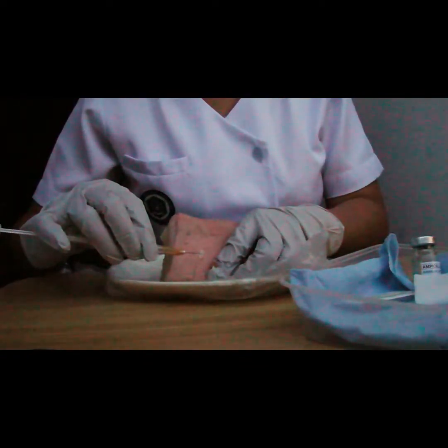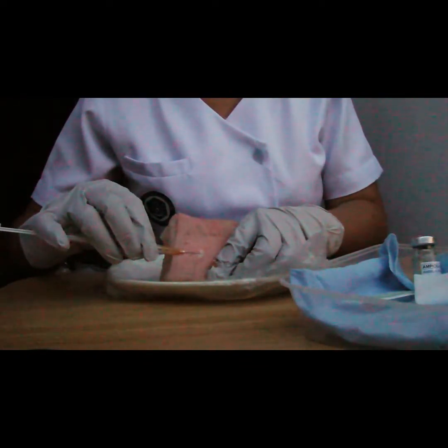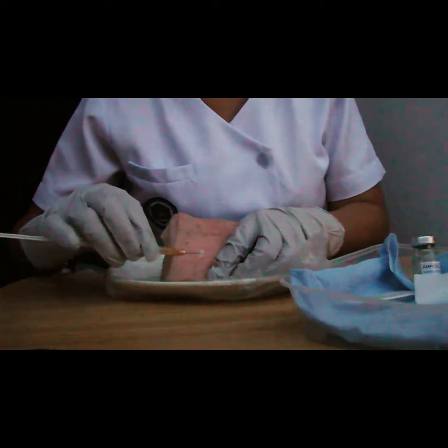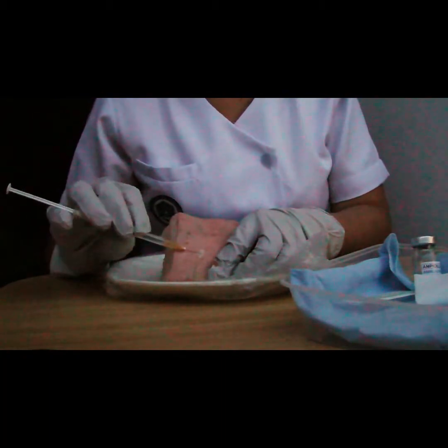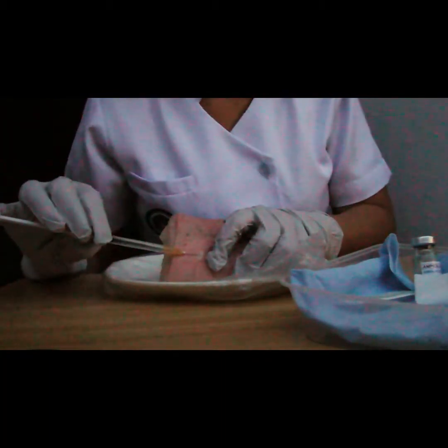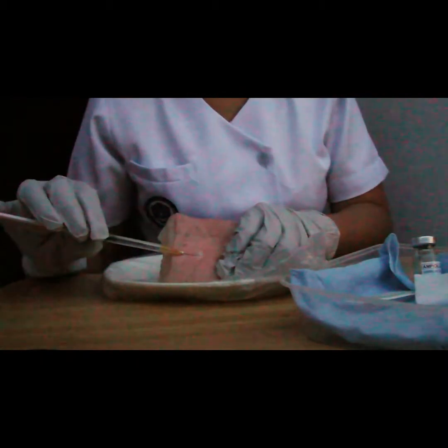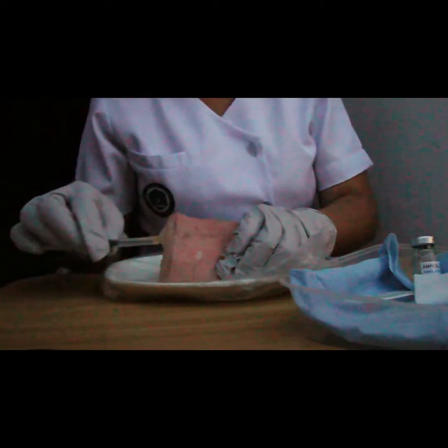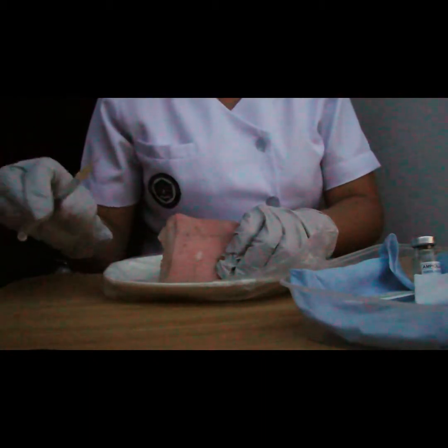Stabilize the syringe and needle and inject the medication carefully and slowly so that it produces a small wheal on the skin. This verifies that the medication entered the dermis. Since we don't have a band-aid, hindi siya available.